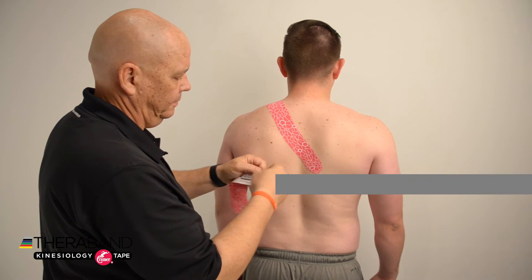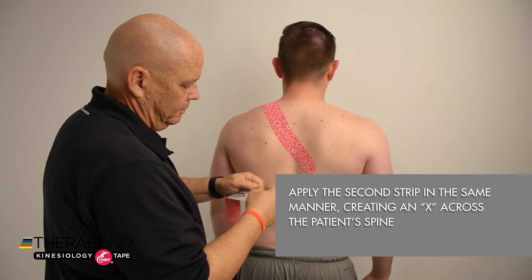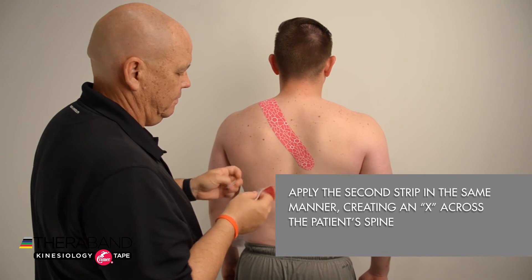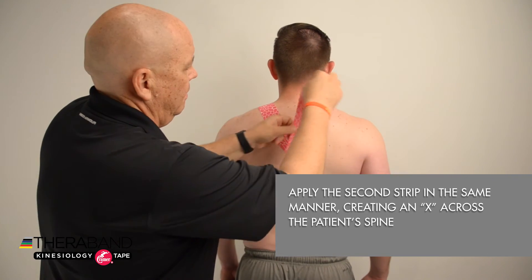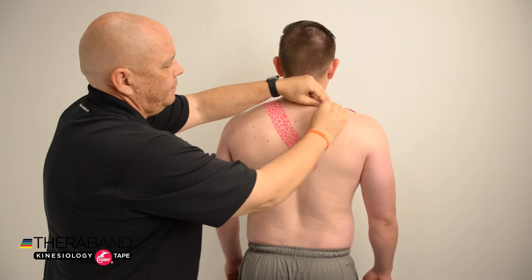Next, we're going to apply the other kinesiology taping strip in exactly the same manner — breaking the backing for our anchors, removing the paper backing, and applying one anchor without any tension on the contralateral side of the upper trapezius.